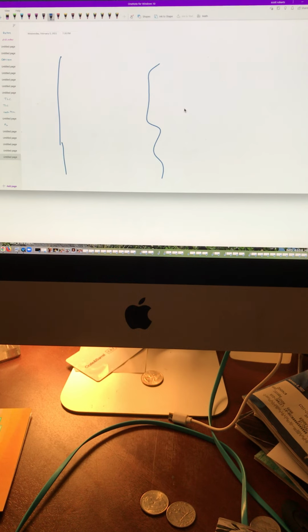Okay. ELISA is insanely important, and this is enzyme-linked immunoassay. So what does this do? Well, ELISA is kind of cool. For ELISA, we're looking for this protein, let's say. So here's a protein. It's a very expensive and time-consuming test, so really, we only do it as a reflex. We usually don't do it as the first test out of the gate.